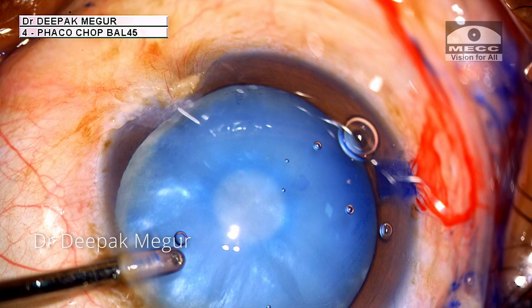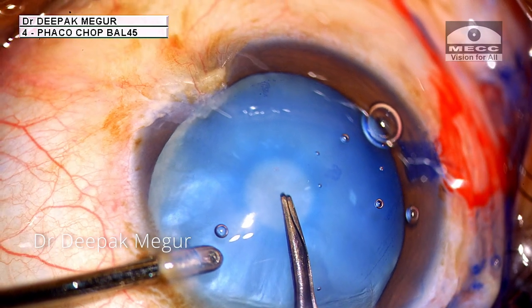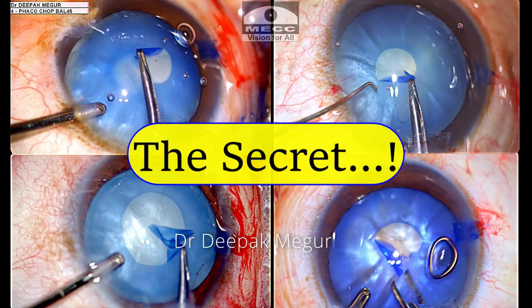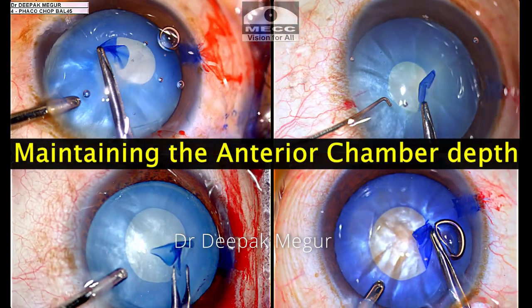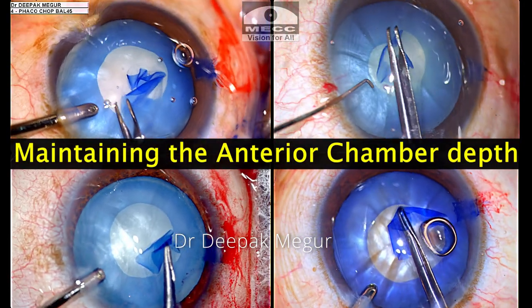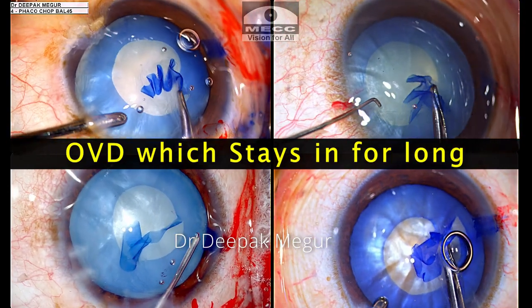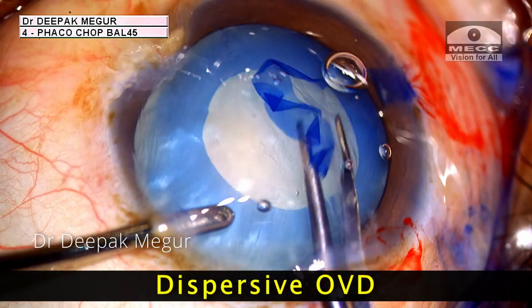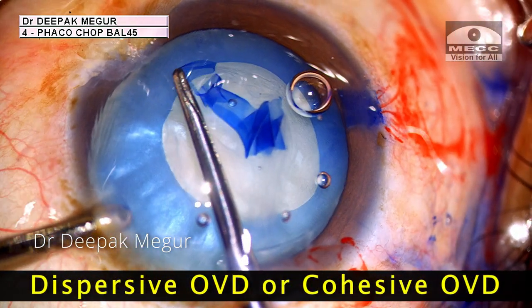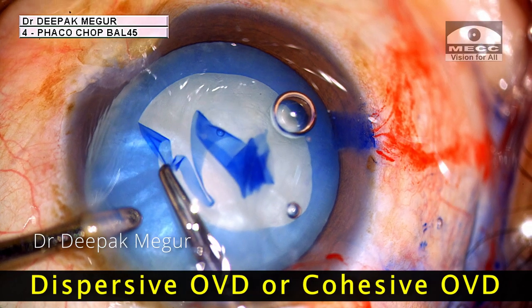This is a swollen lens with shallow anterior chamber, packed with thick swollen cortex in the peripheral parts of the bag. The same whirling technique is used to create the rhexis. There is one important secret critical for the success of this technique: maintain the anterior chamber depth throughout the completion of the rhexis. Since we go two or three rounds before the rhexis is completed, chamber maintenance becomes difficult as OVD escapes out. The key is to use an OVD that stays long during all these maneuvers — I prefer dispersive OVD, a combination of chondroitin sulfate and sodium hyaluronate. One can also use cohesive OVD alone, that is sodium hyaluronate. They maintain the chamber well and we can go as many rounds as needed to enlarge the rhexis.